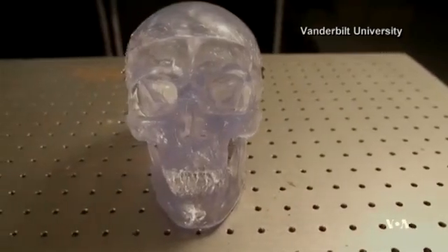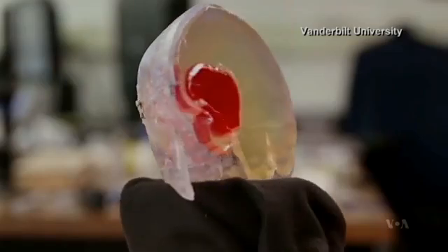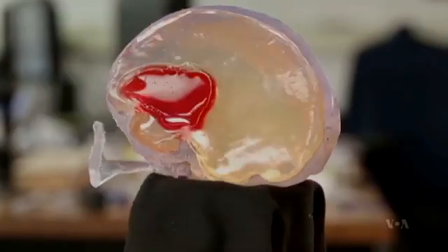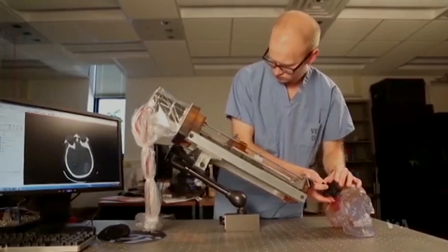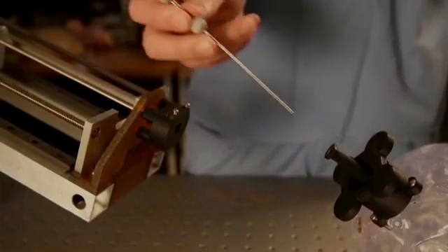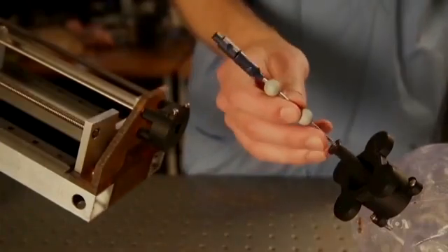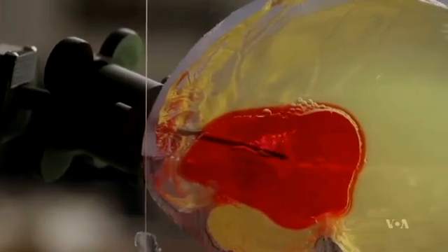This is a mold full of gelatin shaped like a brain. The red portion represents a blood clot. Researchers at Vanderbilt University are using the gelatin to test a robot equipped with a steerable needle designed to get to the clot and remove it without damaging the surrounding tissue.